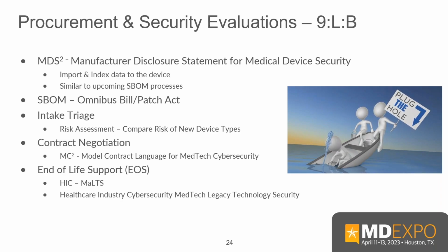And then as we start talking about end of life, end of support, end of guaranteed support, all these different shades of gray on devices: the manufacturer develops a product, and that takes X number of years. Then it's got to go through the FDA approval process. That takes X number of years. The operating system on these devices sometimes is out of date before it ever even gets sold to the hospital. So legacy, that's why the FDA is saying, I want to know what your patching process is going to be. I want to know that this can be updated. I want to see what your voluntary vulnerability communications disclosure program is going to look like, because you have to assume risk on this thing that you're going to help fix it along the way, because we've got 15 more years of this device that's going to be at the hospital.